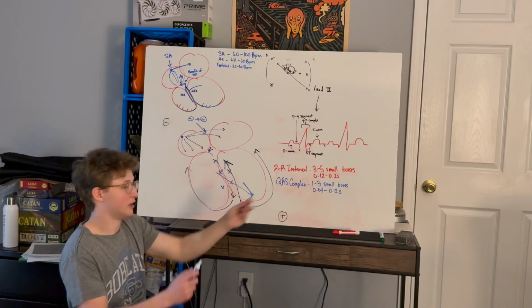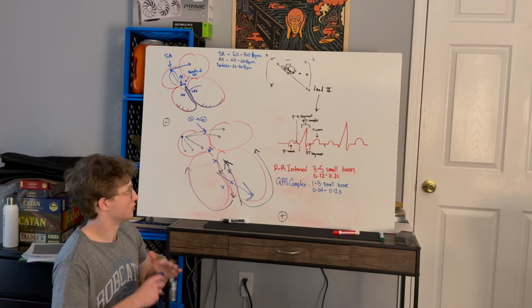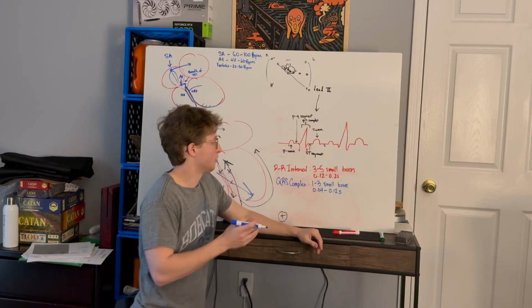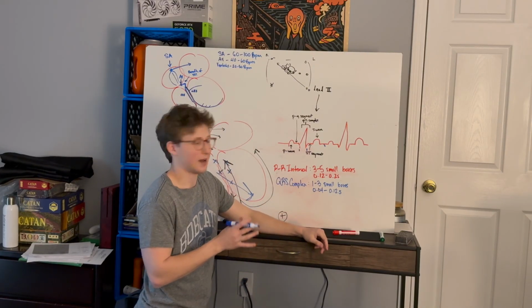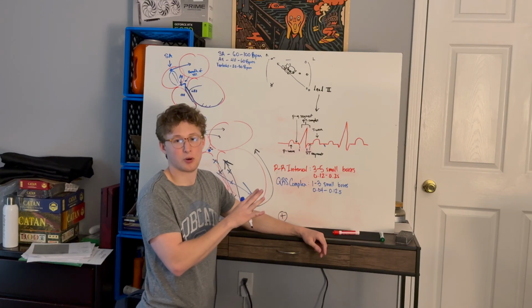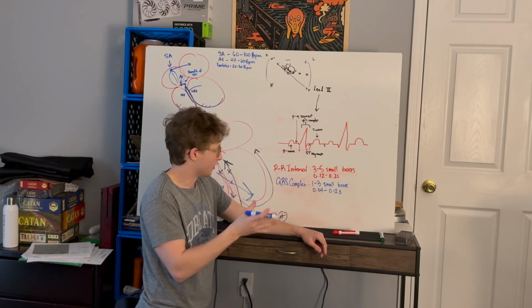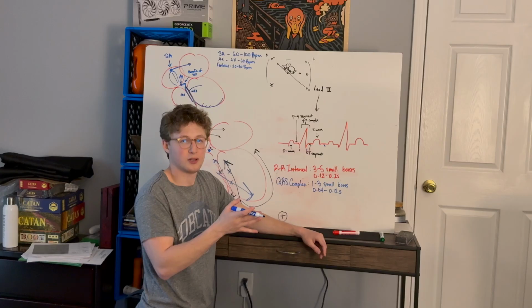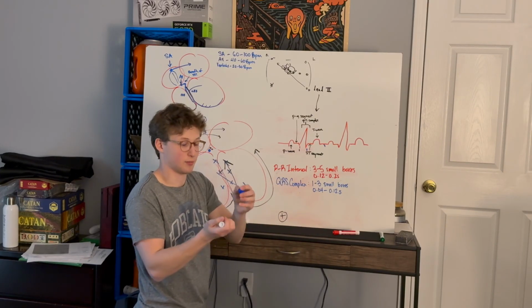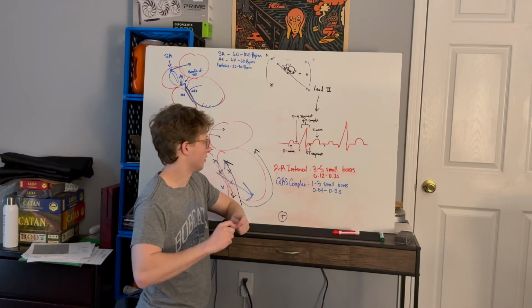Extremely important. I'm going to talk about it a lot. Okay. And then for the last one, actually, for now we'll just talk about PR interval and QRS complex. The other important ones would be QT interval, and then ST segment, but just for now, that's not that important for the arrhythmias we'll be talking about.